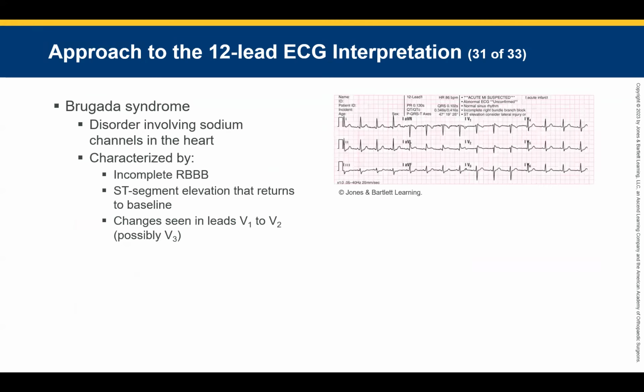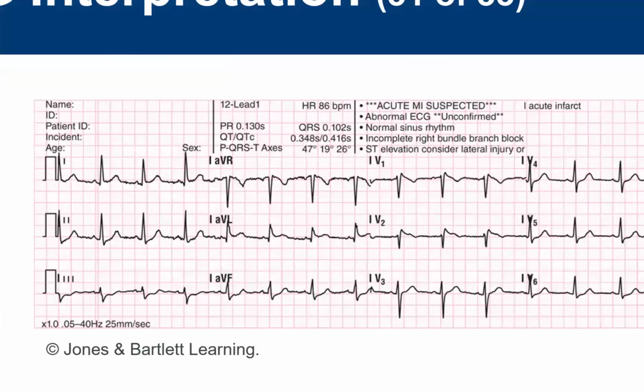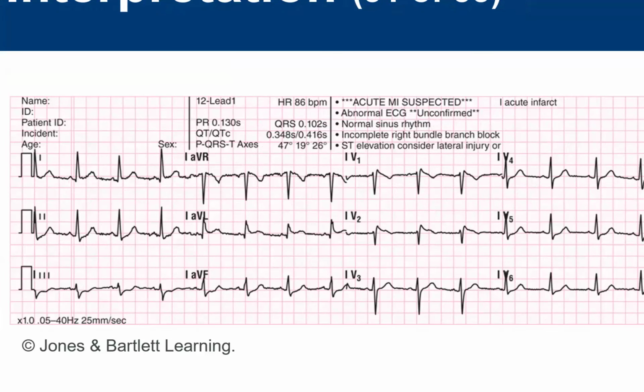Let's do that one. So are we looking for STEMI right now? We're always going to look at our base rhythm. We're going to figure out what that base rhythm is, no matter what, and then we're going to identify whether or not we've got a STEMI. Okay? All right, so this is a good example of a 12 lead that's not my favorite.